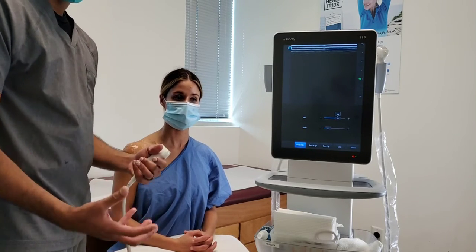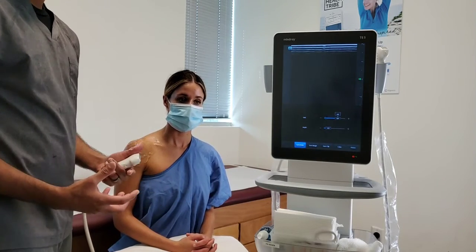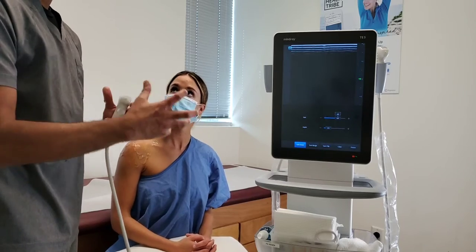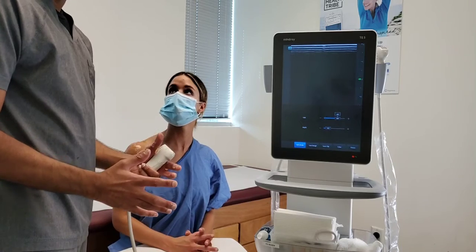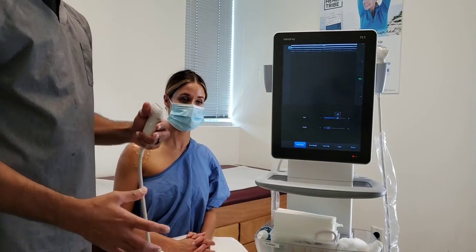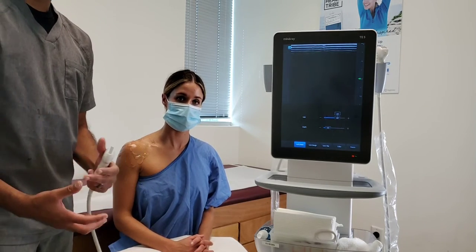But one big advantage of diagnostic ultrasound is that we can look at things dynamically. So you could see that as I was looking at the shoulder joint, I was rotating in and out, and I could visualize how the structures move when a patient is moving, not just static, standing still or lying still, such as with an MRI or an X-ray. So overall, diagnostic ultrasound ends up being a very important tool in our tool belt in order to figure out what exactly is going on with a patient.